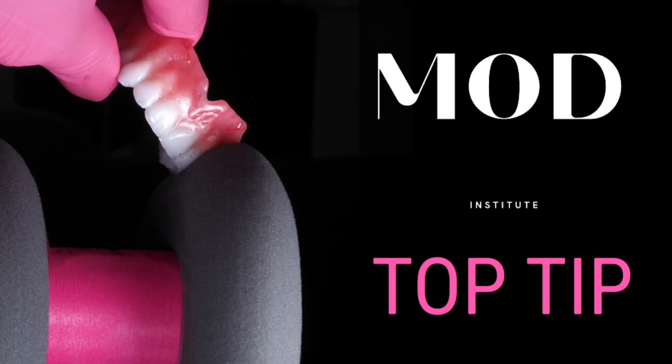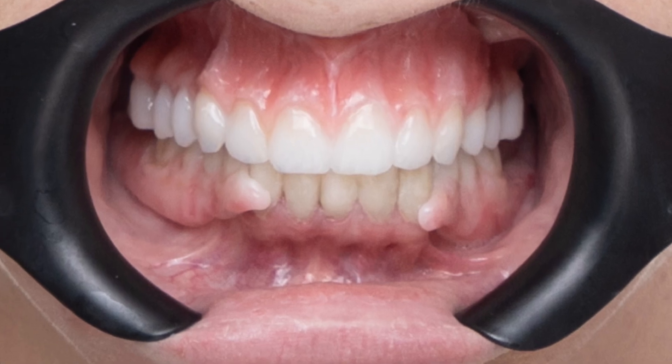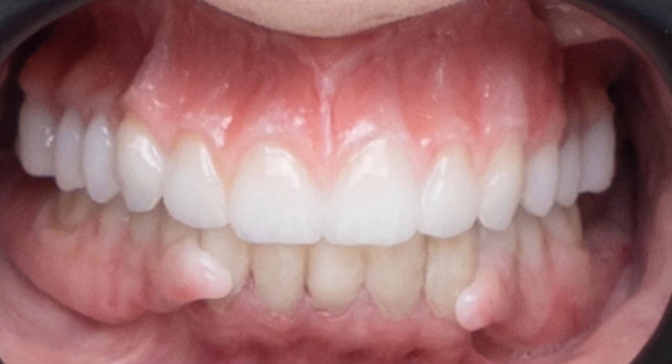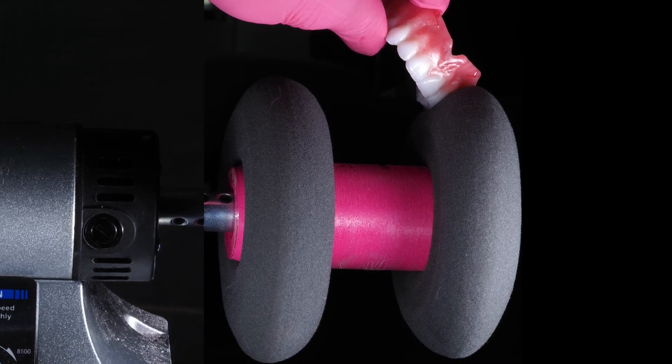The Mod Institute top tip: how do we keep our 3D printed dentures looking amazing years down the road? Here we have a denture over 30 months down the road — a 3D printed denture with a candy coat and a high shine looking amazing. Let's take a look at this technique because it's ultra critical.